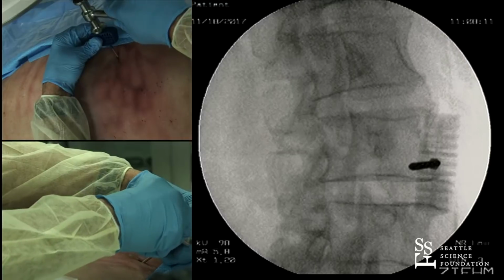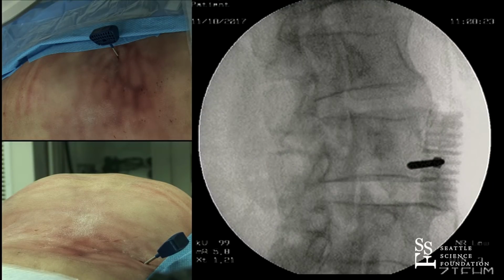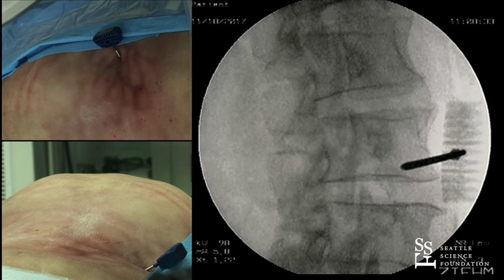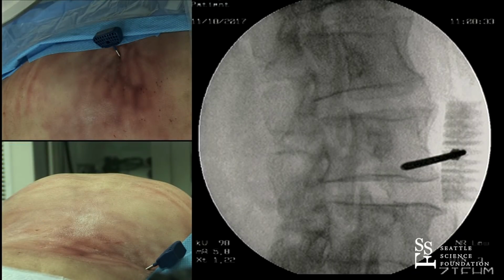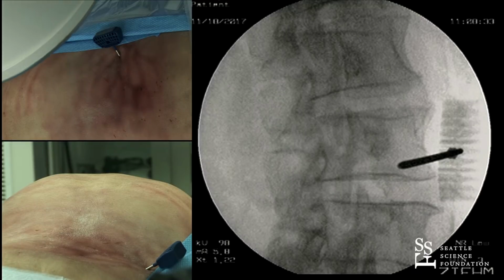So I feel bone at that point, and I'm very satisfied with that position. That's exactly the relatively avascular, aneural spot that we have. It should be completely avascular because any of the major vessels are already in the center of the vertebral body or just anterior to it. So we have about a 45-degree angle, maybe a tad more, and we want to come from that position. After saving that image, we want to take a lateral view because it's, at this point, easier to go lateral.